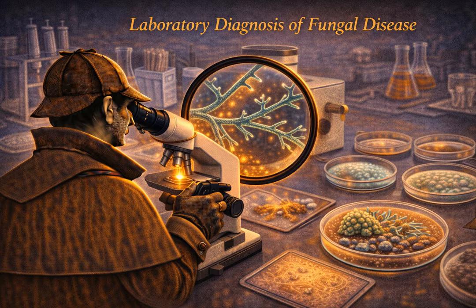Absolutely. With bacteria, you have this luxury of speed and numbers. You swab a throat, you plate it, and you have millions of colonies the next morning. It's like playing checkers. It's fast, it's reactive. Fungal diagnosis, that is 3D chess. You're dealing with organisms that hide deep in the tissue, organisms that mimic human cells, and organisms that grow so slowly that, honestly, the patient might be dead before the colony ever appears on the plate. Which is a terrifying thought, but it really sets the stakes for this discussion.